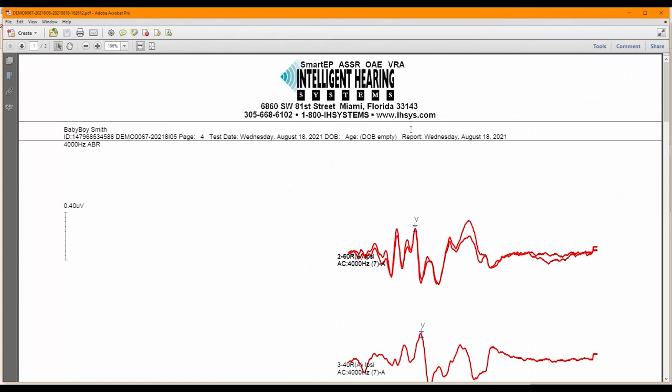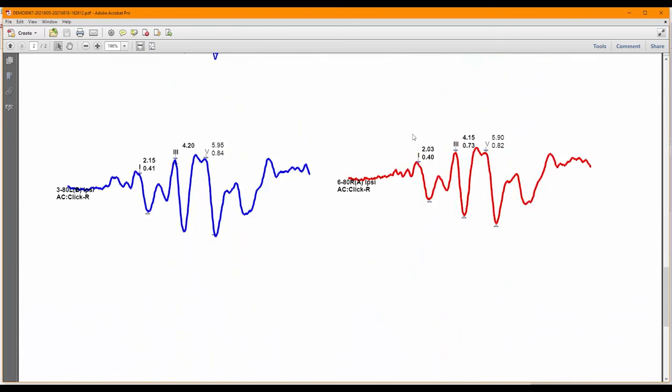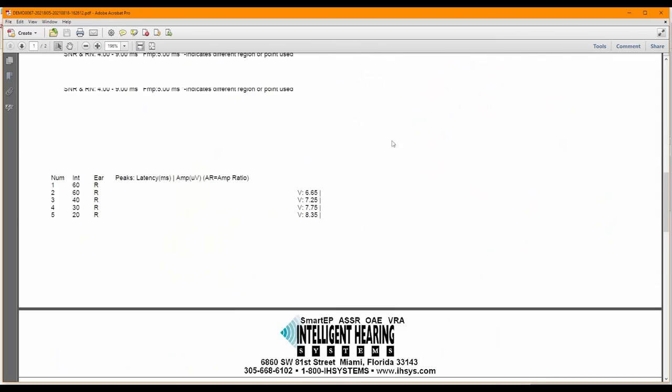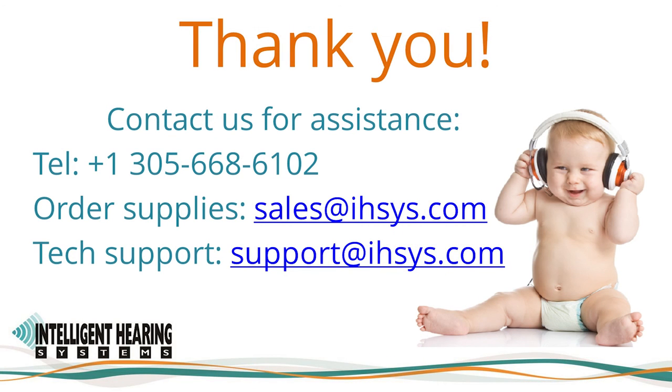When you are ready to print, I recommend printing a PDF preview or saving the report as a PDF file so you can see how the report will look before printing. If you would like to change the logo and use your own logo on the report, please contact our technical support team and we will be happy to guide you through the process. Thank you very much for taking the time to watch this training video. Please do not hesitate to contact us by calling our office or sending us an email — our sales and support teams are available to assist you.